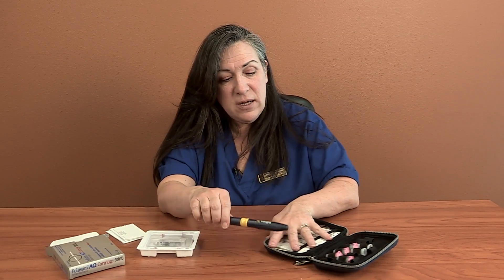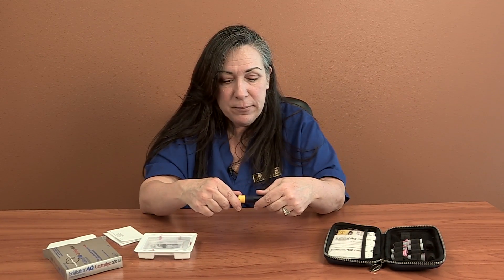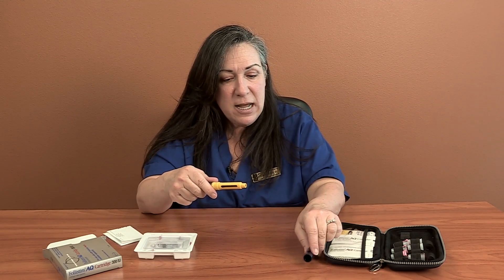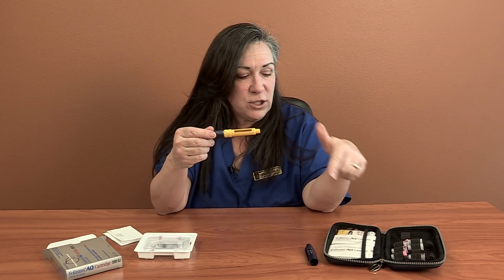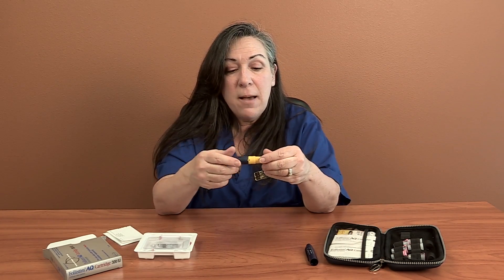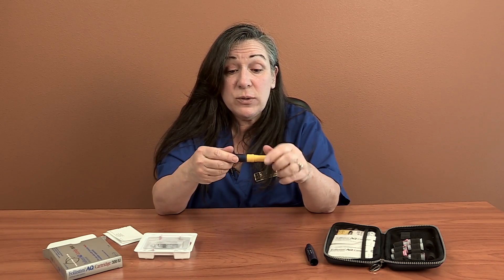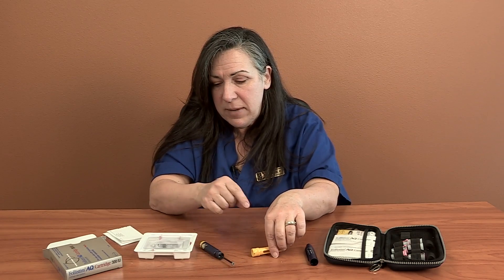Easy enough to use — this is just going to be another subcutaneous injection like we've been doing all along. The pen, almost like an ink pen, is how I'm going to put this together. This just uncaps. It's just an empty pen right now, and you'll have lots of written instructions, pictures, and all kinds of things in here. This little thing right here just untwists right in the middle, and what I've got to do is put the medication in it.